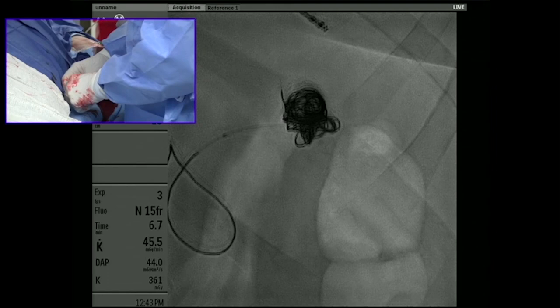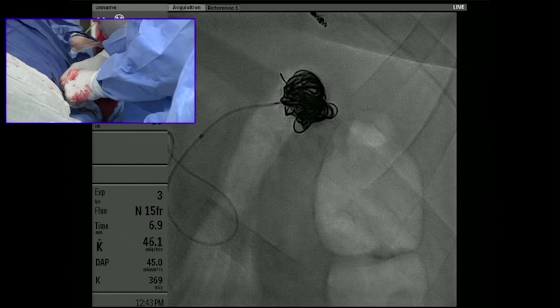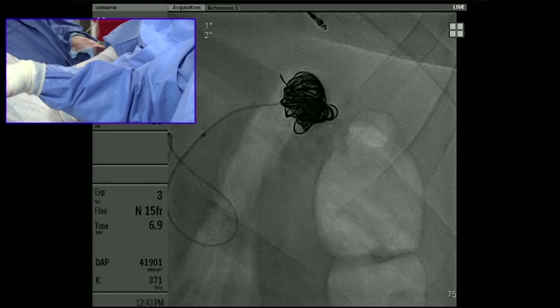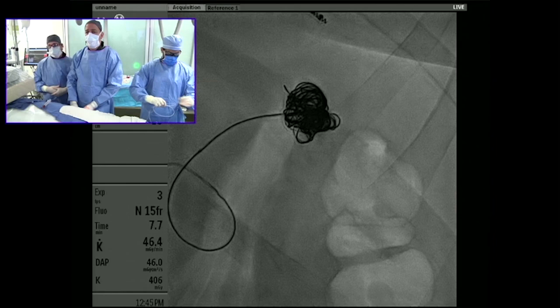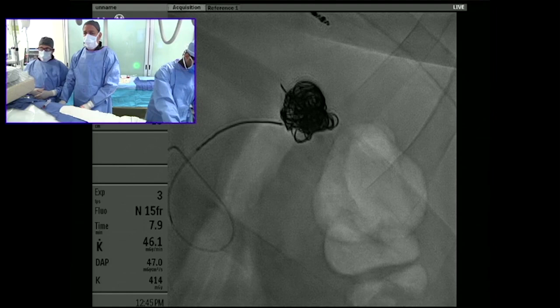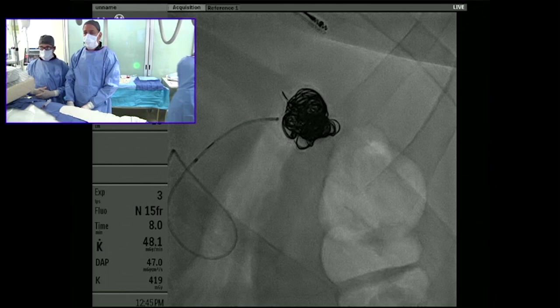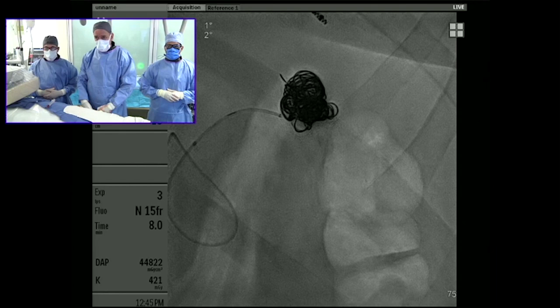If we embolize into the two or three outflow vessels, antegrade flow to the spleen will significantly decrease, but collaterals — the short gastric arteries and gastroepiploic vessels — will supply the parenchyma, so we typically don't see splenic infarction. We stop when coils start pushing out into the inflow artery. We want to densely pack the entire sac. Since she is on Coumadin, we want the packing to be very tight to ensure thrombosis.